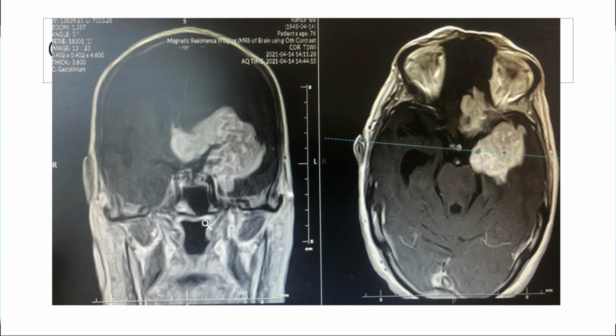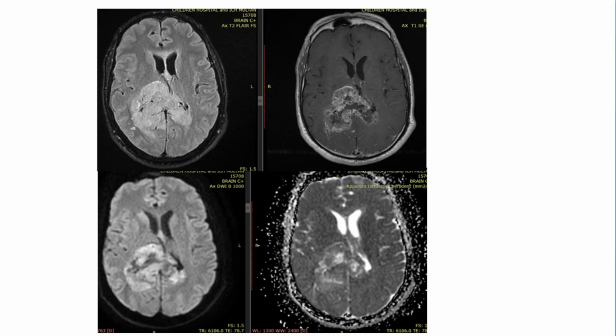I didn't feel it's really invasive. By the location of it, it was lobulated and all that, but I didn't have much more to comment on. But this patient, just by the look of it, as you just said, with the diffusion weighted images and all, this was a high-grade tumor.